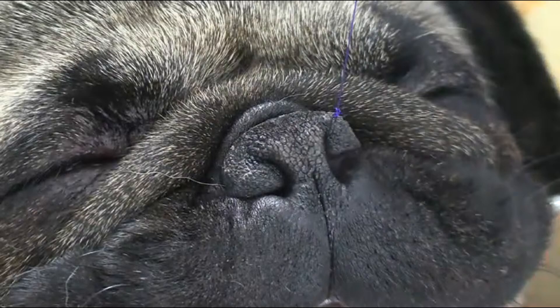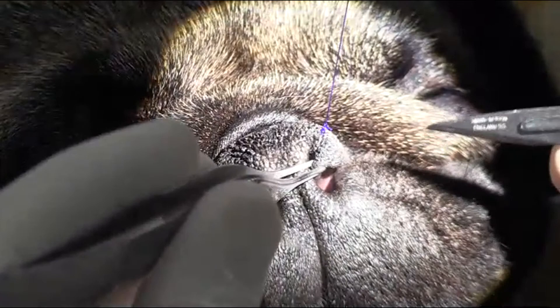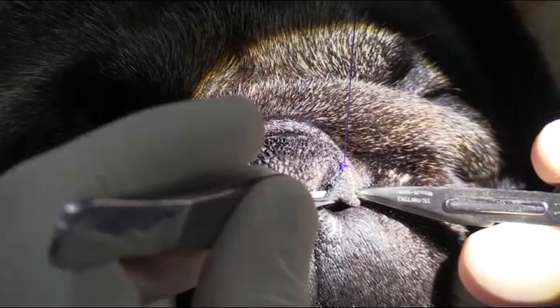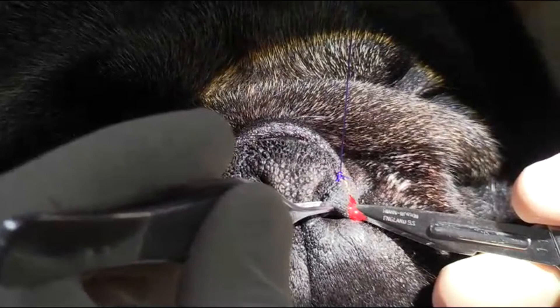First thing I do is put in this stay suture and then I make my wedge cut. The key with these is to make sure that you go deep enough with your cut so you're actually taking some of the volume of that alar fold out. So we're going right in here and switching over to another set of thumb forceps.